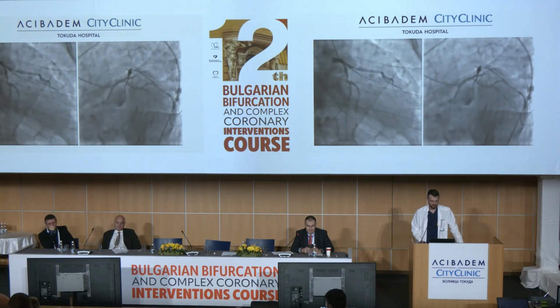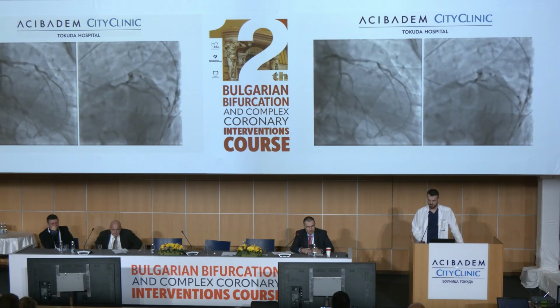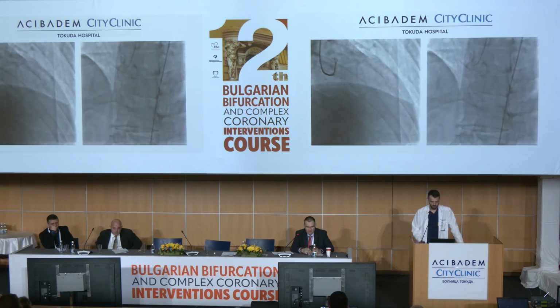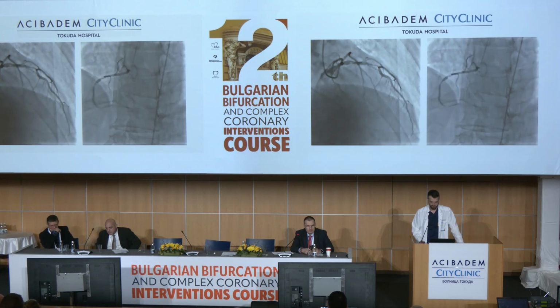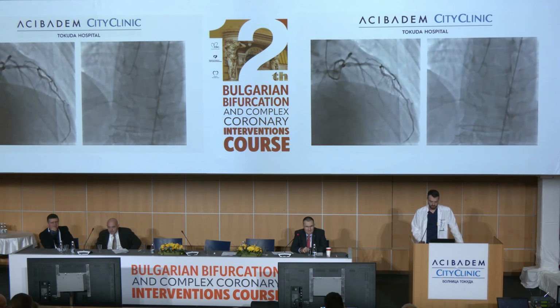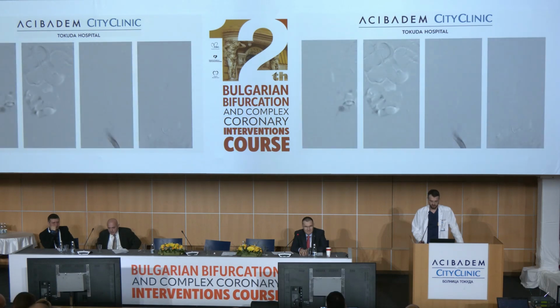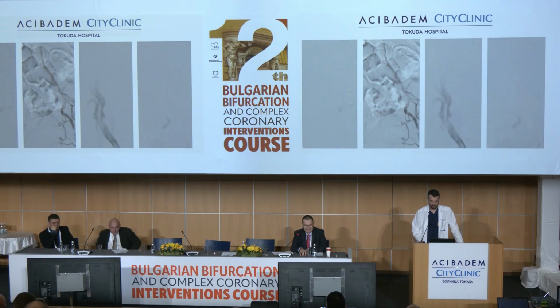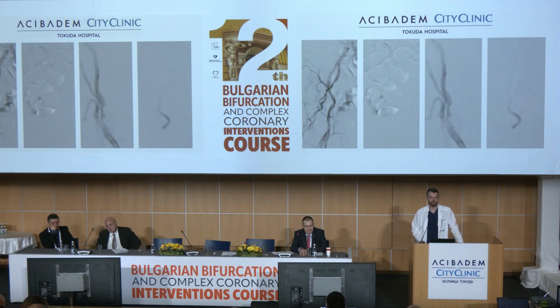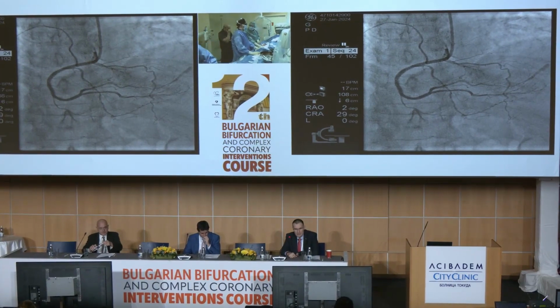So this is the actual angio. As you can appreciate, there is a severe proximal LAD lesion followed by a stented segment, and after that another, let's say, moderate lesion. You can appreciate that also from the cranial view. The right is also diseased. There is a severe proximal lesion followed by a stent and another distal lesion. I told you that he has peripheral artery disease. You can appreciate the access site. Both iliacs are stented, and there is still other disease there. Also, the carotid arteries are diseased. So that's the case. We continue with the second live case.